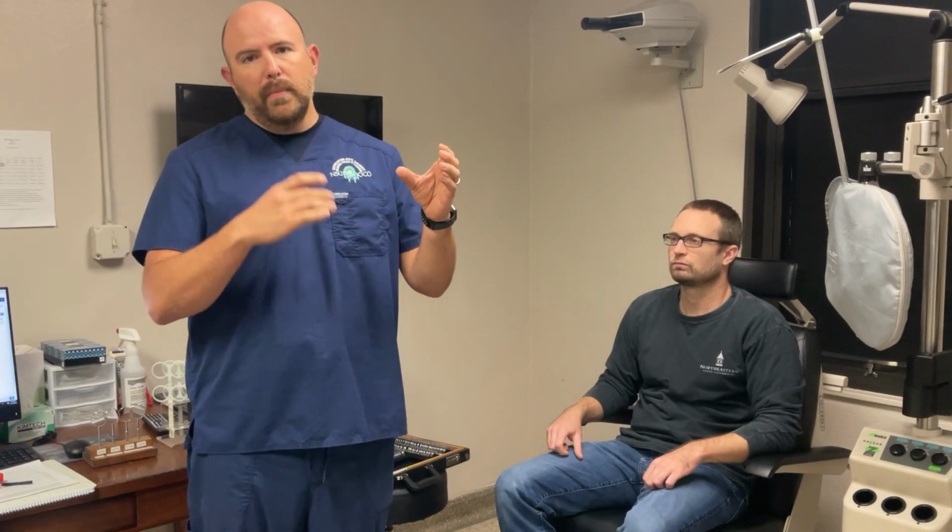So what we have to do is use a very simple formula where we take their Snellen acuity, the denominator, divided by 100. Say for instance that our patient's Snellen acuity is 20/100. We would take the 100, divide it by 100, and that would give us a just noticeable difference of 1 diopter. Every time we show the patient a spherical change, we need to change that by 1 diopter at minimum.